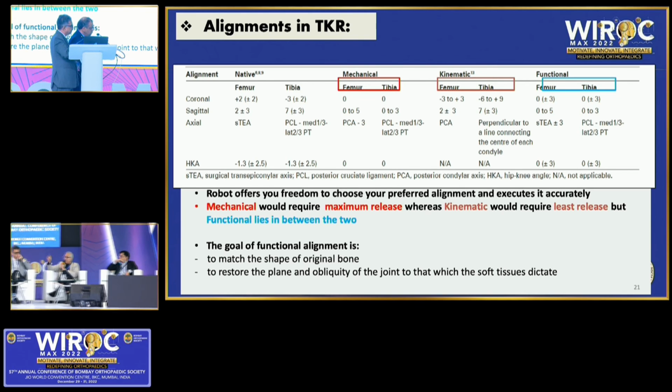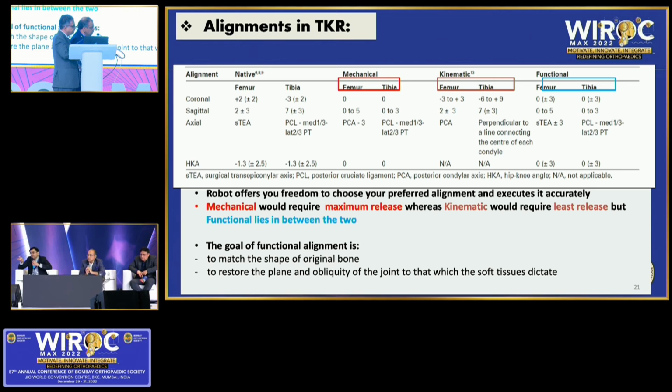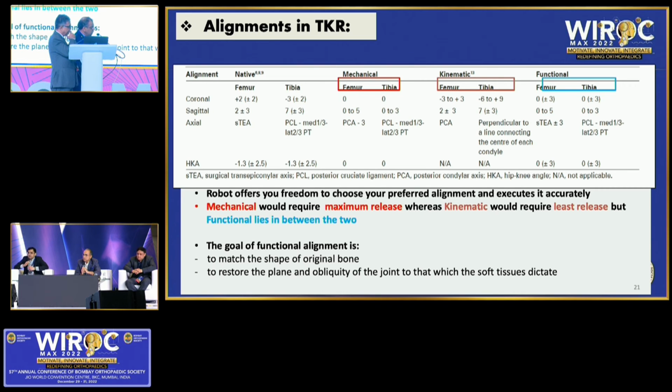But the balancing has to be good. That's all. I've moved on from mechanical to functional for sure, because it's giving you the play of keeping your tibia in 2 degree varus or your femur. And I think that's making me release less, with equal, rectangular gaps. So I'm quite happy with that. Rather, I feel when we were behind mechanical, most of the obese females never used to be happy with their thighs rubbing against each other. So I think we are learning also with the robot, because it's giving us an insight into so many things you can see on the screen which we never knew when we were doing the conventional. Of course, navigation was giving us an idea, but surely moved on to functional.